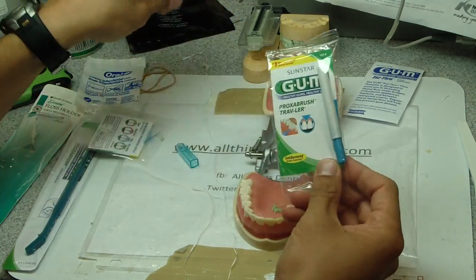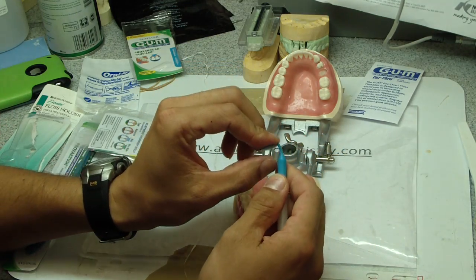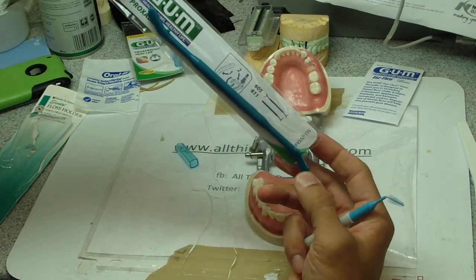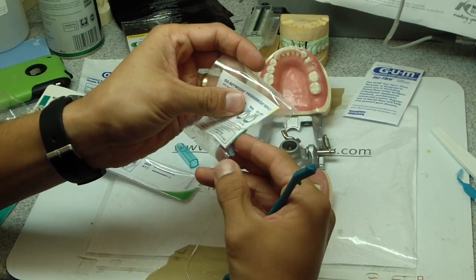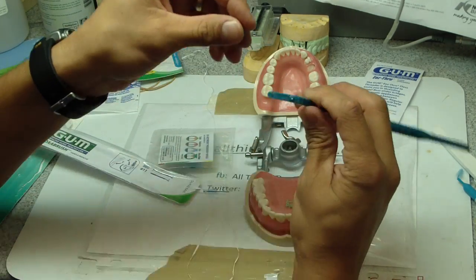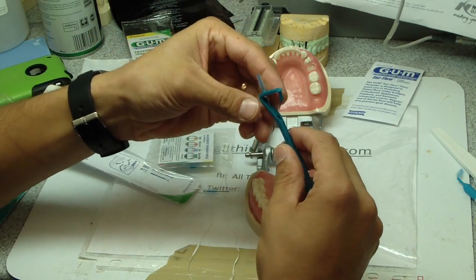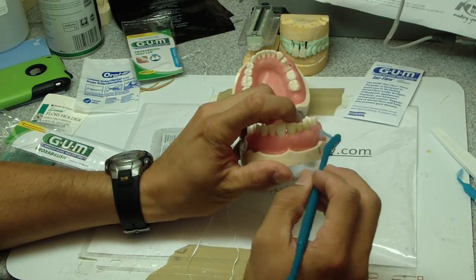Next is another version of the proxy brush, and you can bend it to get into different angles. Here's the handle for another one. The way this works is you take the little Christmas tree and put it into the hole. See the little groove — how it bends it down. Boom — and then you can use this. This gets underneath the bridge perfectly.